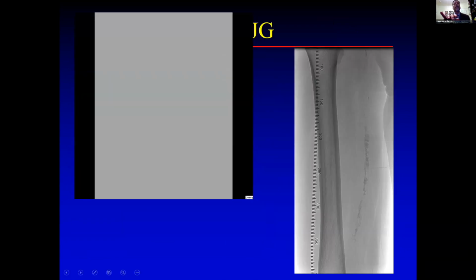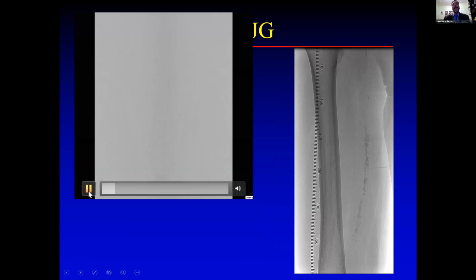significant claudication. And then if you look at this same case, but just a different patient, this is a long lesion of around 12 to 15 centimeters, heavily calcified. And directional atherectomy is not a panacea. You can see here with this first panel, let's go back real quick. Look at the delivery of this. When that cutter gets proud, as we say, because it bows out, you can have complications, and this complication is real.